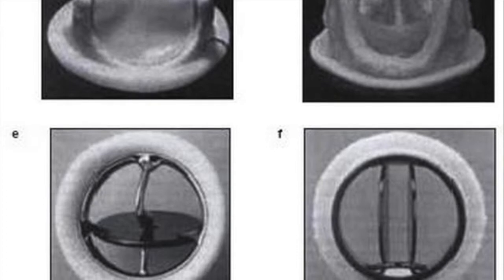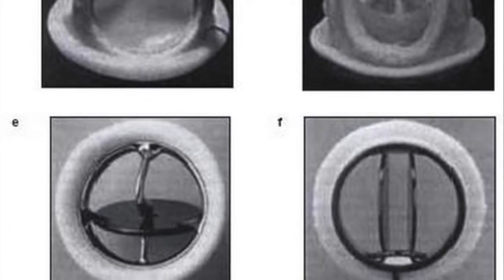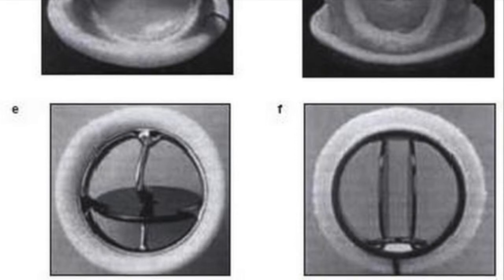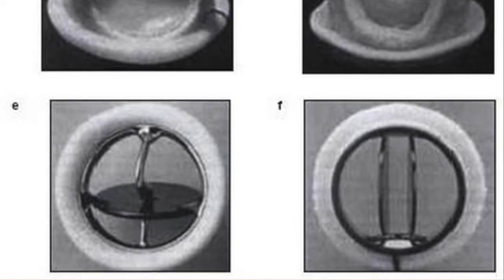Younger patients should lean towards the mechanical heart valve because the danger of getting multiple heart surgeries to replace expired tissue valves far outweighs taking more medicine. Older patients, however, may very well get a tissue heart valve in order to reduce the amount of necessary medication.